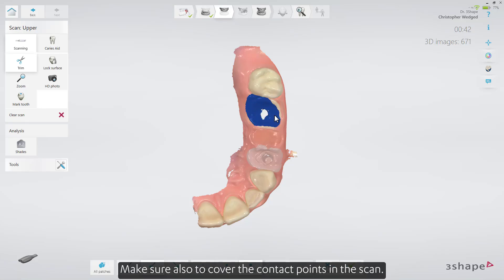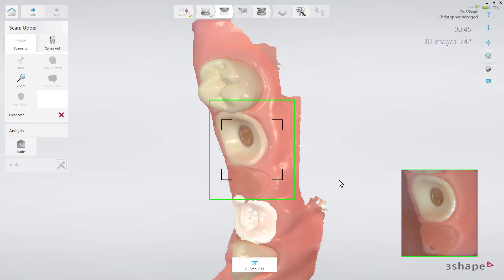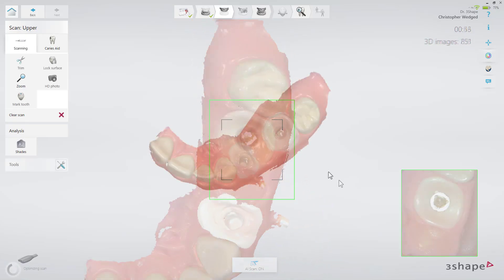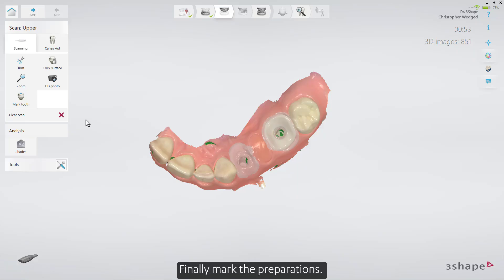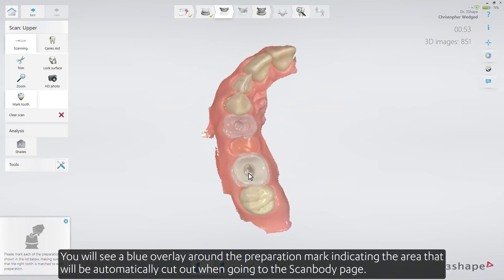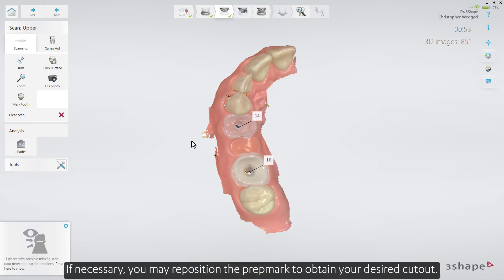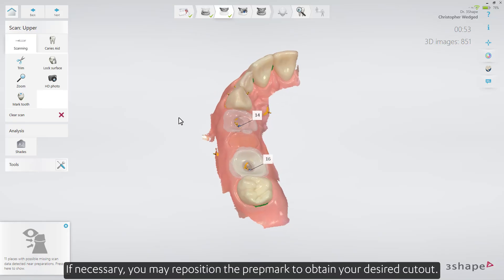Make sure to also cover the contact points in the scan. Finally, mark the Preparations. You will see a blue overlay around the Preparation Mark, indicating the area that will be automatically cut out when going to the Scan Body page. If necessary, you may reposition the Preparation Mark to obtain your desired cutout.